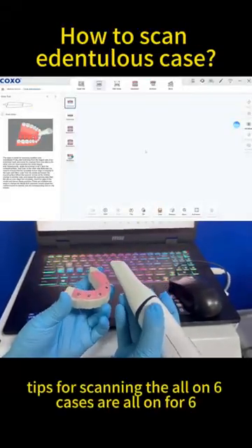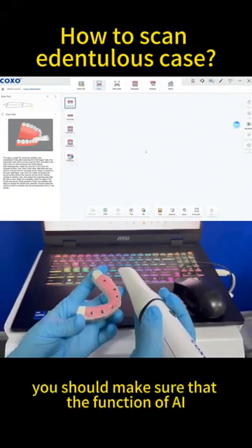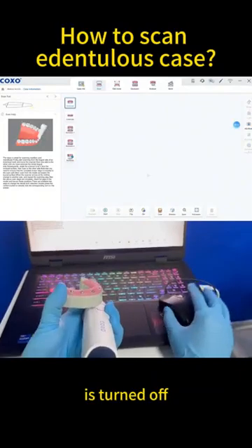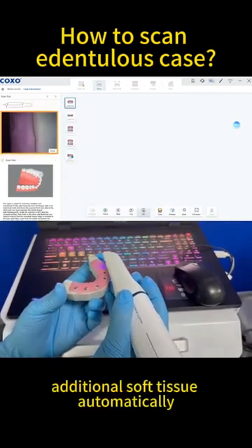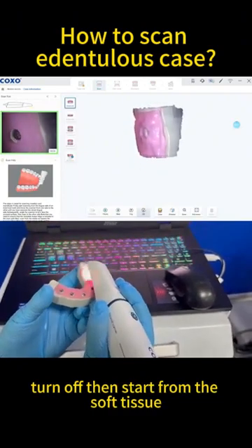The critical tips for scanning all-on-six cases, or all-on-four-six: you should make sure that the AI function is turned off, because when AI is on, the software will automatically remove the additional soft tissue. With AI turned off, start from the soft tissue.